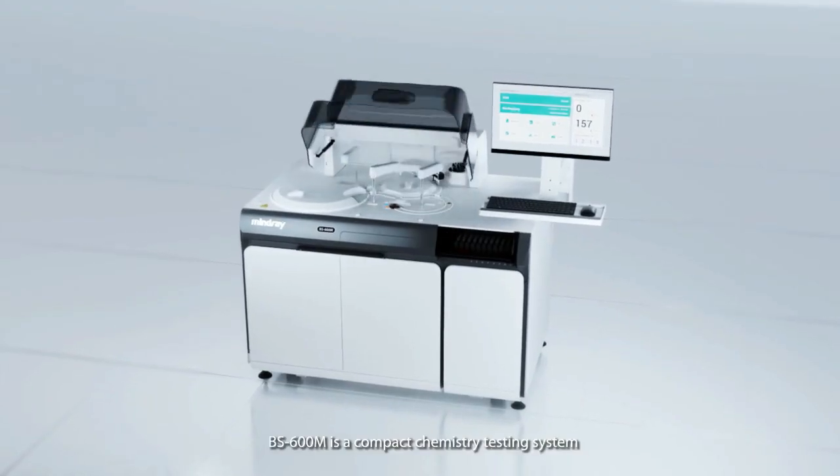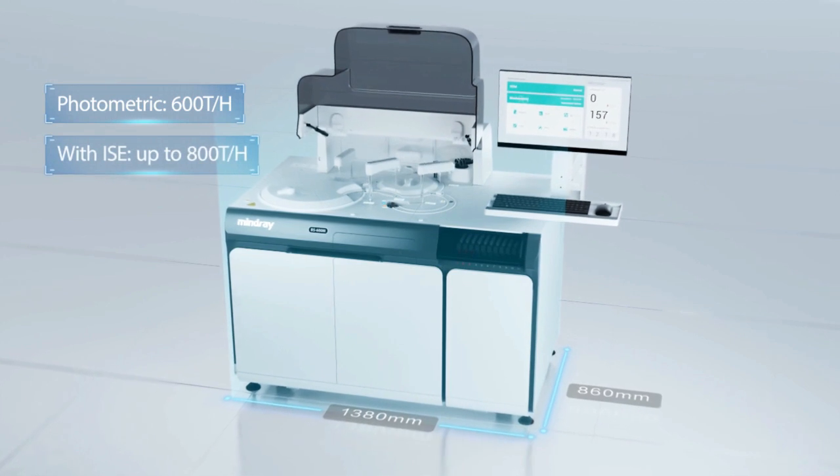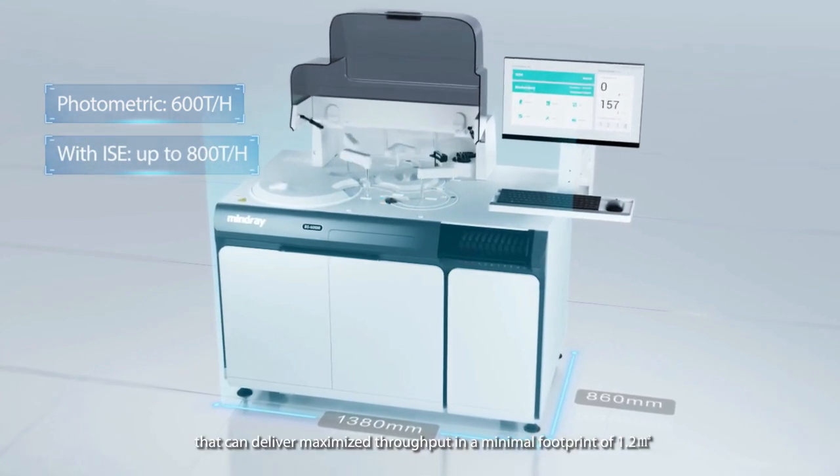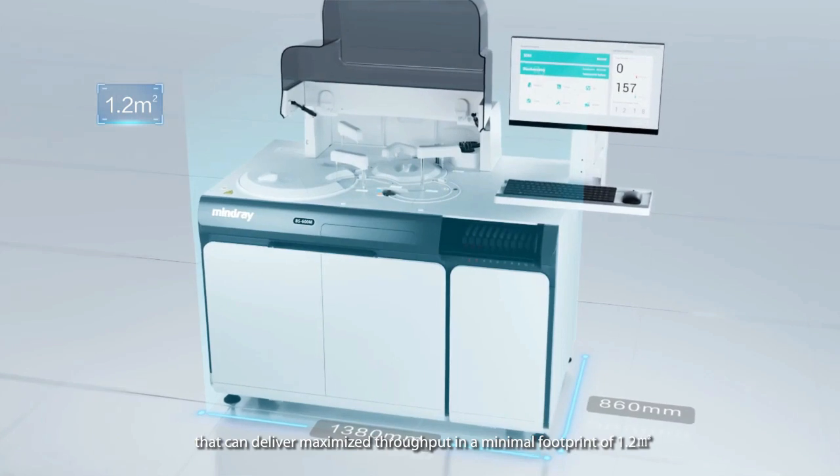BS 600M is a compact chemistry testing system that can deliver maximized throughput in a minimal footprint of 1.2 square meters.